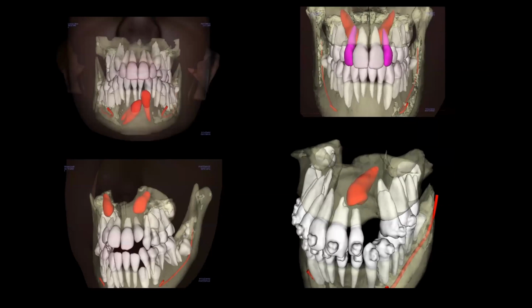These are just different images of in vivo models with patients who had a variety of impacted canines. The freaky threes, I call them, right? For those of you who understand the Palmer nomenclature system, right? These impacted canines can be some of the most difficult and riskiest orthodontic treatment plans that we know of, right? There's all kinds of risks that patients have to accept, right? So the better armed we are with that information, the better we can manage that risk and make sure that the patients clearly understand that risk.